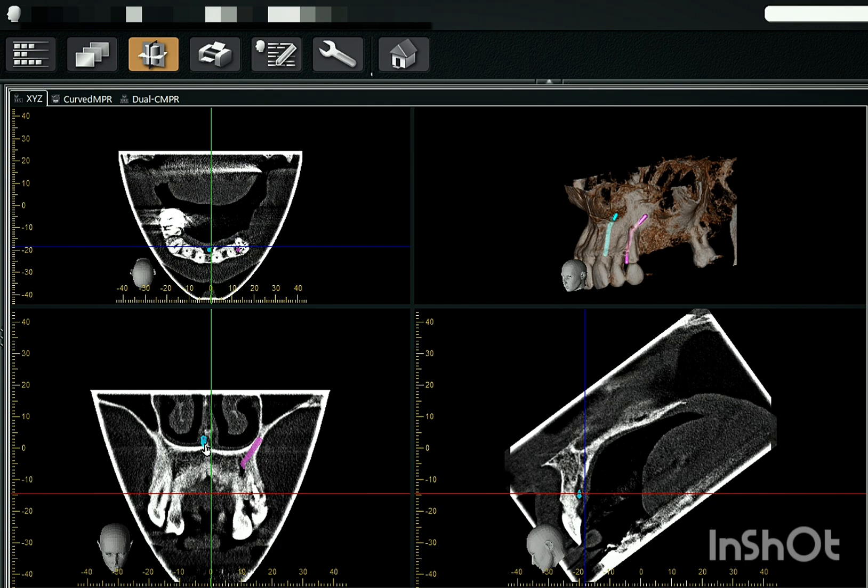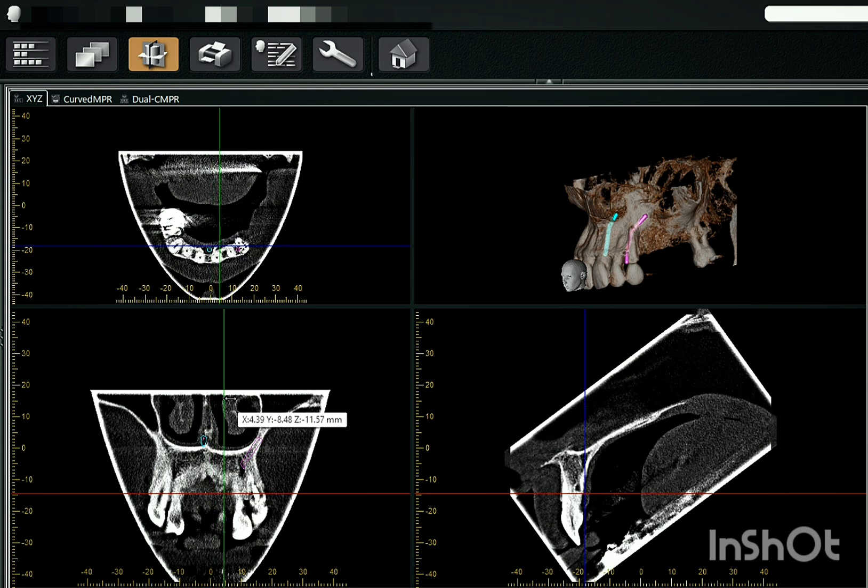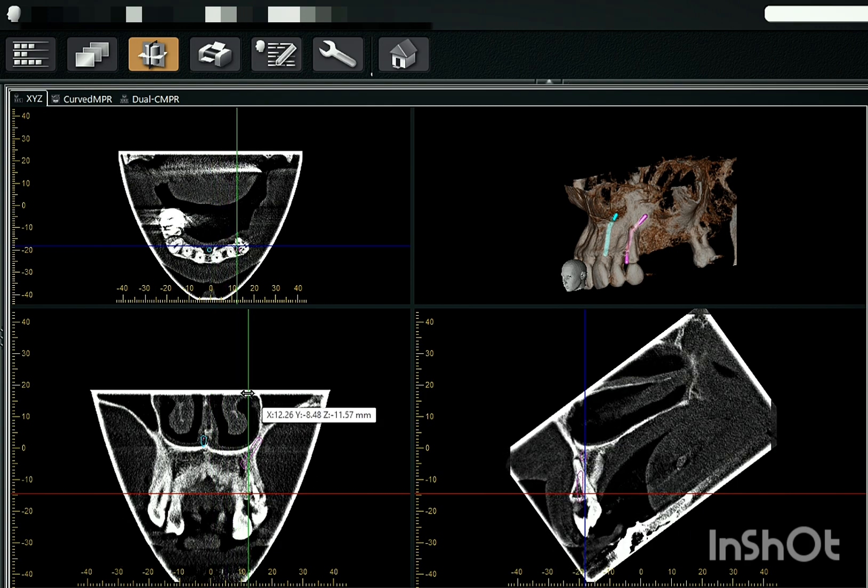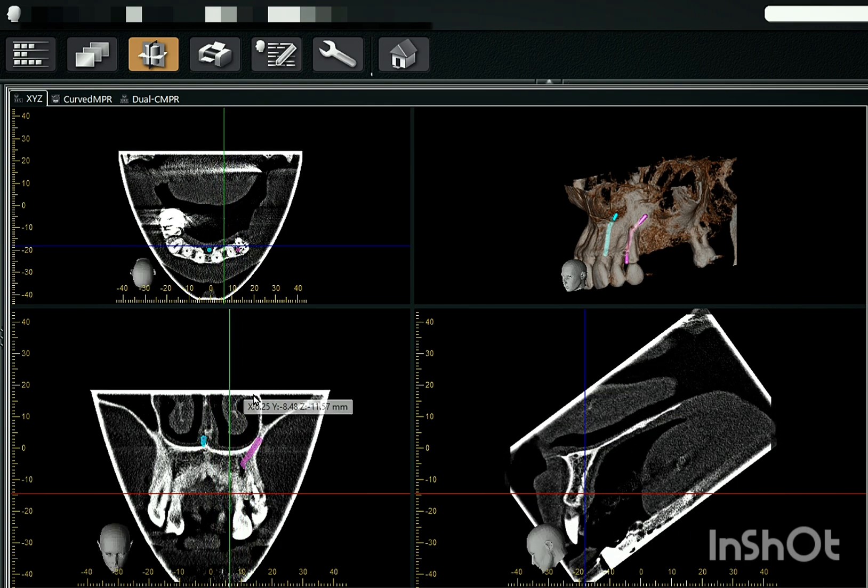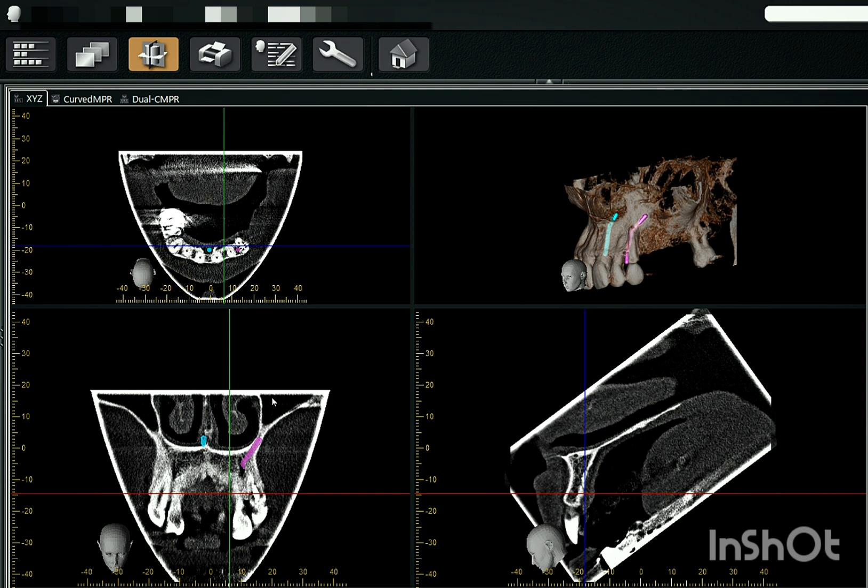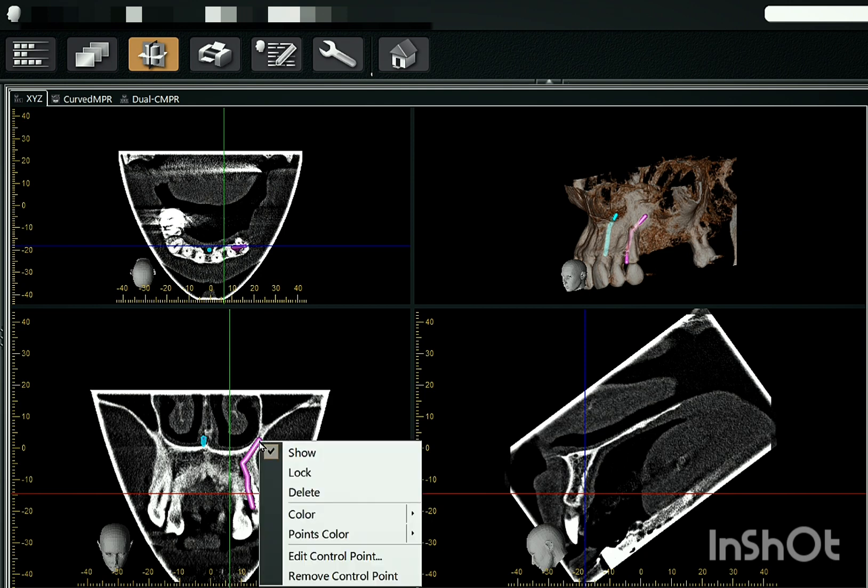So basically, this anatomical landmark is very important because the implants are usually placed in this region. So one of the reasons where dental implant fails in the anterior maxilla is because of this. So basically, it has to be taken care of during extraction as well as during implant placement. Otherwise, there are chances of pain or paresthesia seen in follow-ups.